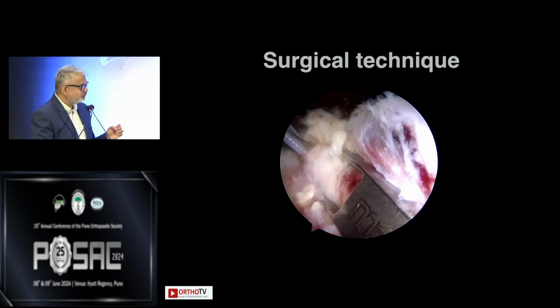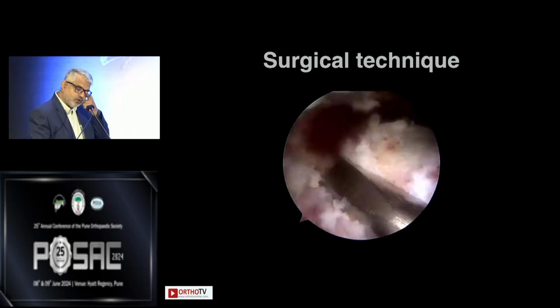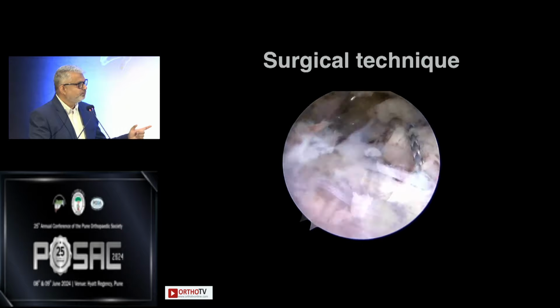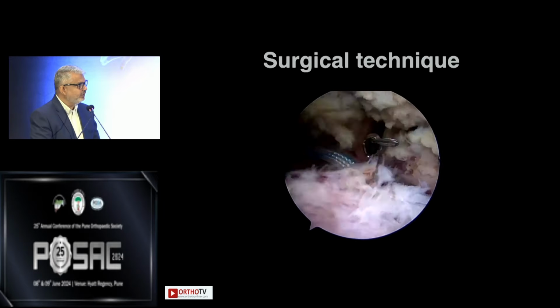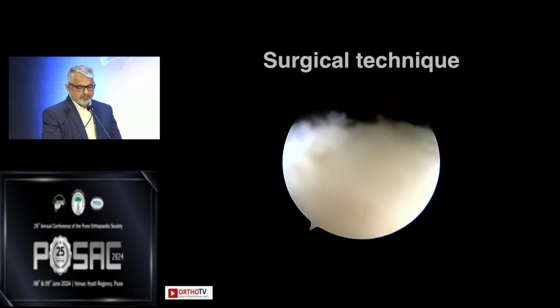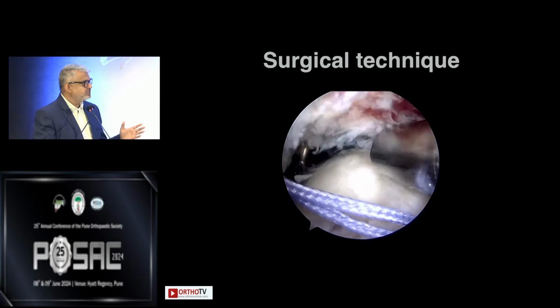Now, passage of sutures, you can either do a direct antegrade passing using one of these self-retrieving devices. Alternatively, you can do a retrograde device. When the fragment is big, you possibly can't use a direct shuttling device because effectively you're going to crush the fragment. And that's where you're going to use a retrograde device, and that allows multiple sutures to pass through. It can be cost effective if you feel that your four limbs are not good enough.